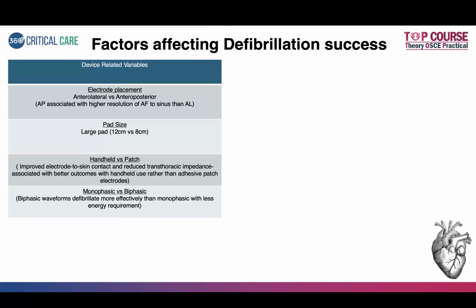So there is a lesser amount of energy that is required. And the advantage is because of that, there is a lesser risk of myocardial damage. But both are almost efficacious. There were few studies that had been done. That's the Orbit study, the Timber study, and the Orca study. I have kept this in the easiest way.